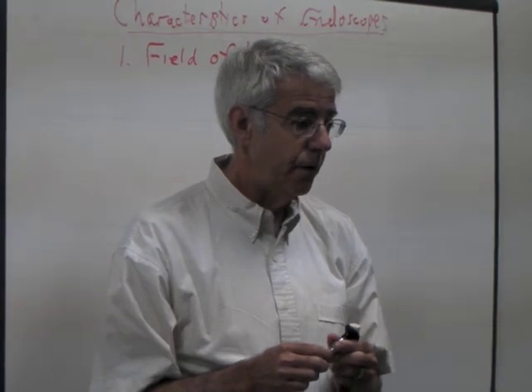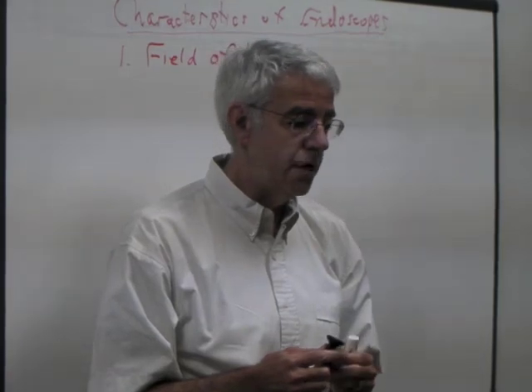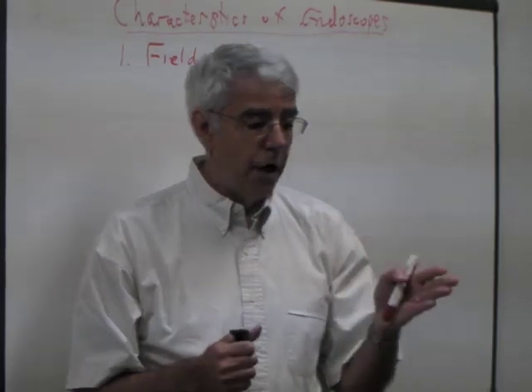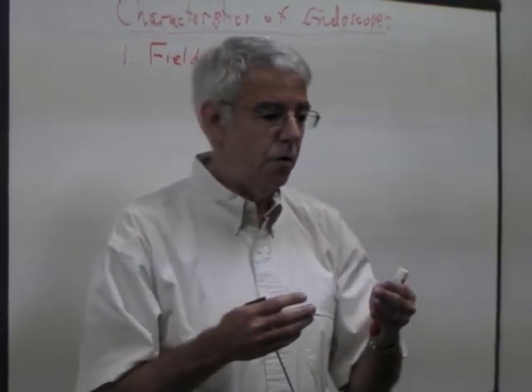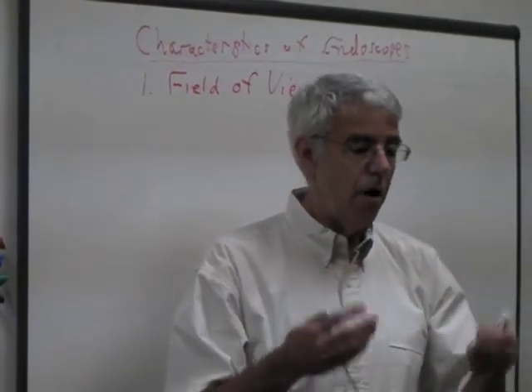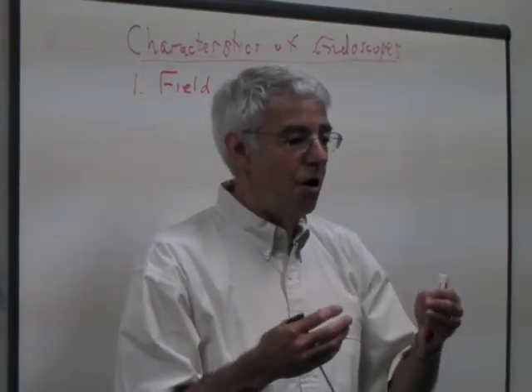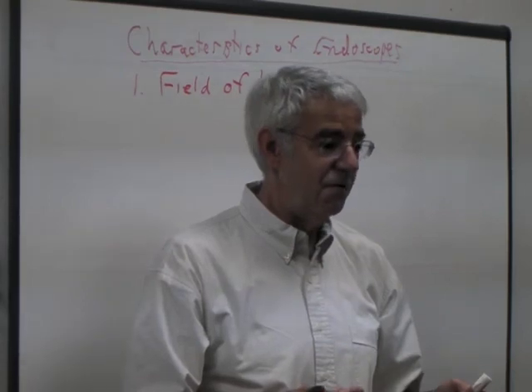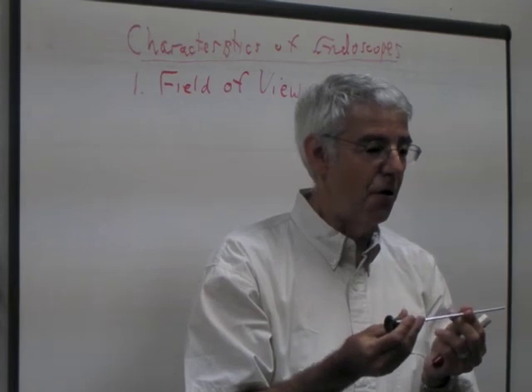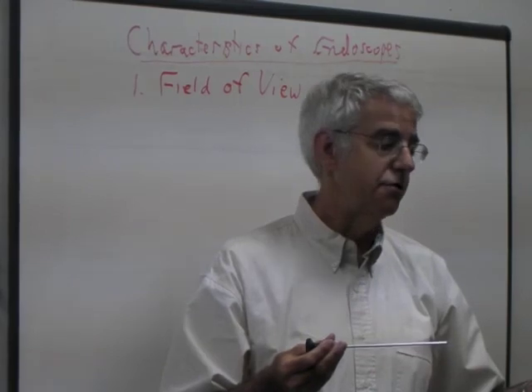So it varies by application? Absolutely. So a laparoscope, which is used for abdominal surgery, typically has a field of view of 70 degrees. And that's a really good point. So field of view is not a figure of merit. It's a property of the endoscope, such that the surgeon wants a typical field of view. They want 90 to 110 field of view on their arthroscope, and they want their 70 degree on the laparoscope, or else they're going to be disoriented.